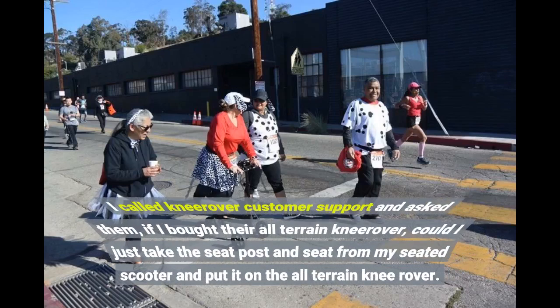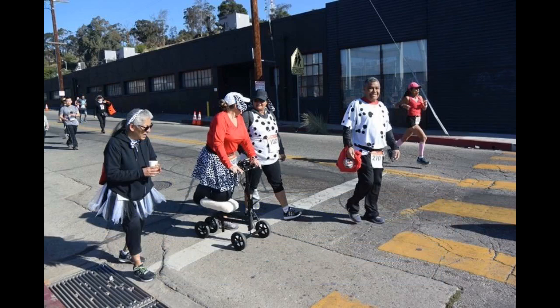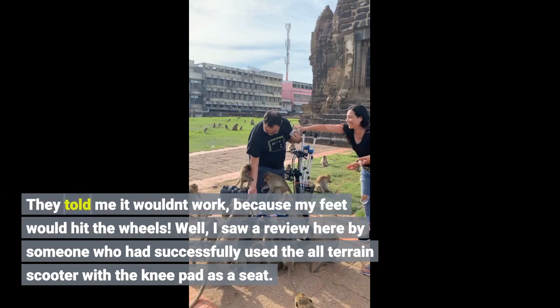I called Nirover customer support and asked them if I bought their all-terrain Nirover, could I just take the seat post and seat from my seated scooter and put it on the all-terrain Nirover? They told me it wouldn't work because my feet would hit the wheels.